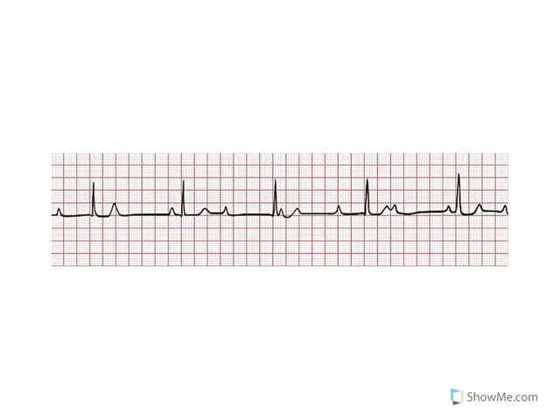And again, you get those people that'll say, third degree heart blocks are wide. The QRS complex is wide. Again, not true. Because if you look at this one, this is a perfect example of a third degree, but it's not wide, is it? All right? What we'll notice about this is that, first of all, the PR interval is variable, because you've got a P wave sitting over here, and then your QRS is right here, and then some P wave here, and then QRS over here, and then a P wave there, so the PR interval is completely variable in this case.